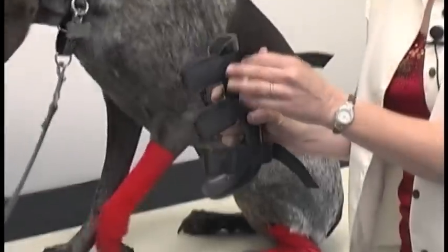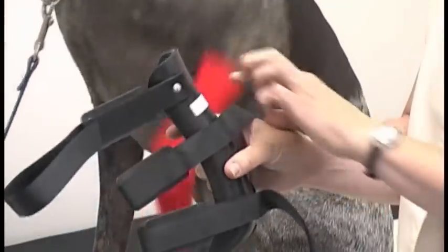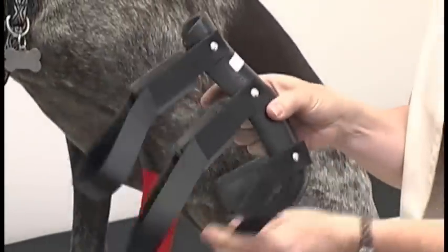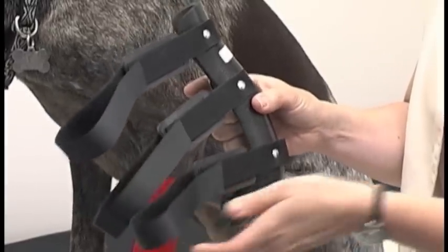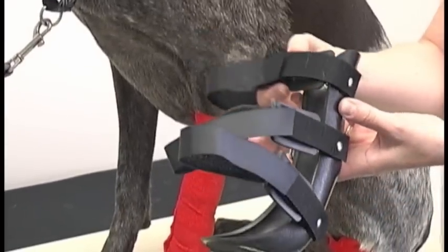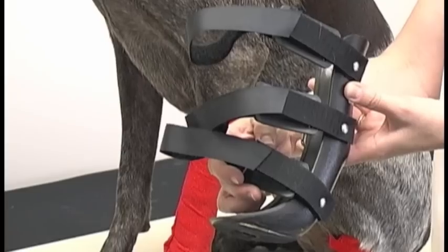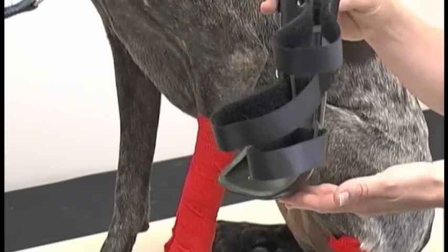The first thing you want to do is loosen all the straps and just tack them down like this, so they're easy to get a hold of when you put it on the dog. You also want to take a look at the straps and make sure that the strap pads are in the middle of the splint. You can adjust them after the fact, but it's nice to have them ready before. This splint looks really good — we're ready to do the fitting.